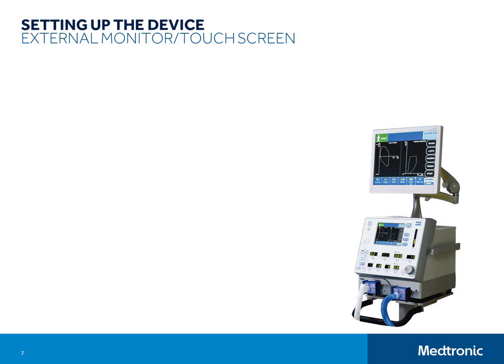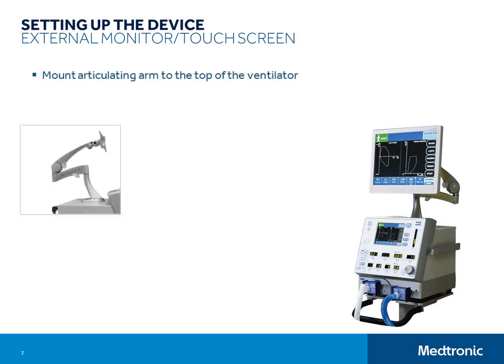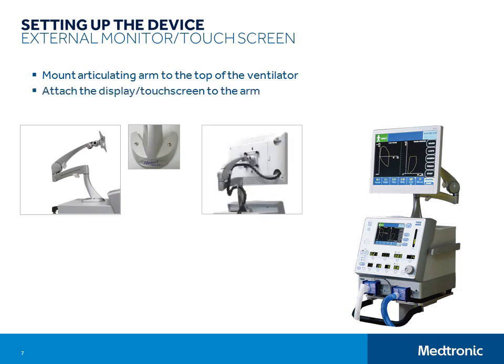This is very simple. You will use the same articulating arm to mount either the 15-inch external touch screen or the 17-inch external flat panel display. The first step is to attach the arm to the top of the ventilator. There are two screws that hold it securely in place. Next, attach the flat panel display or touch screen to the arm using the hardware provided with the system. After the display or touch screen are securely mounted, connect the communication cables.